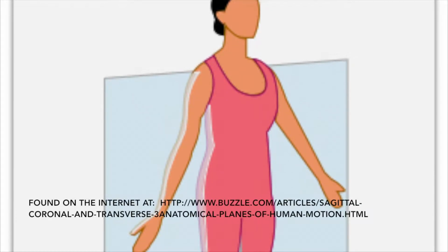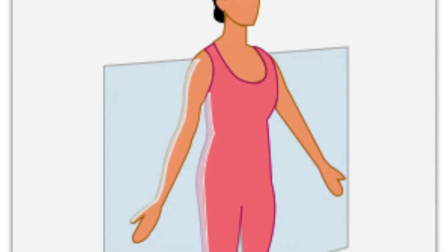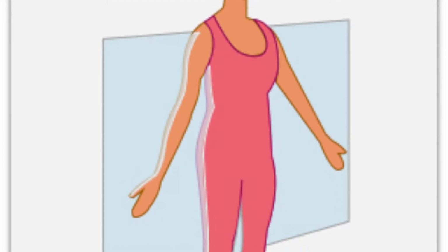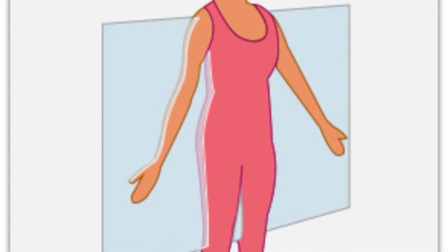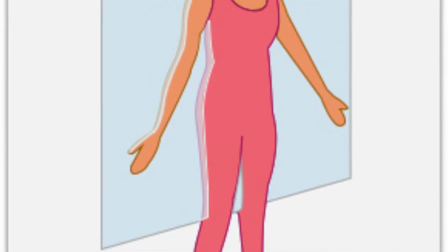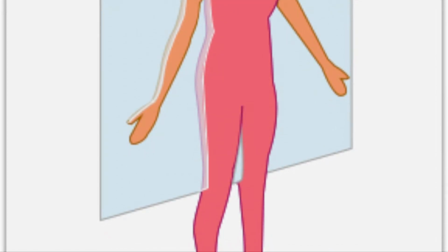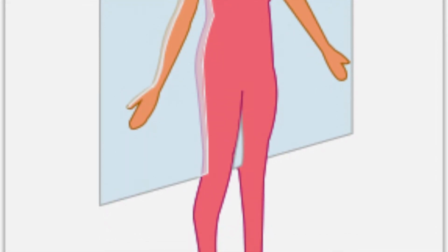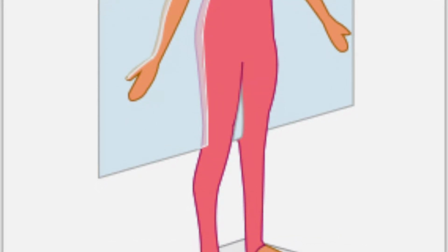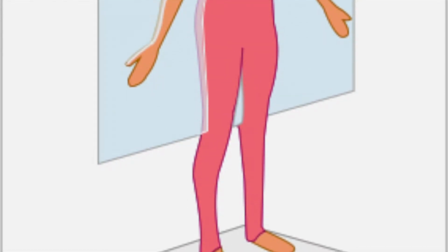And I just want to take a quick second here because I find this is a hard view for some people to really visualize. This is a coronal plane, right? So like I'm showing here in the picture, you're slicing the patient in that anterior posterior plane, and therefore on the screen the liver is to the left and the kidney is to the right, but you're cutting both of those organs also in a coronal plane. So just take a second and really try to visualize this, try to understand this. If you can, the rest of the scan becomes pretty easy, and most of the other views are fairly intuitive if you can understand this one.